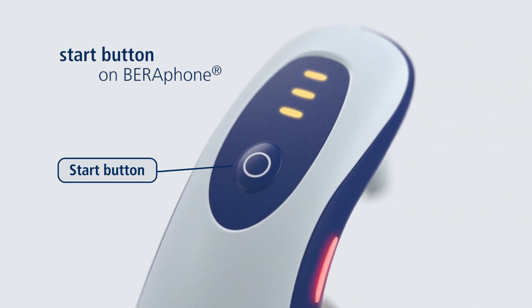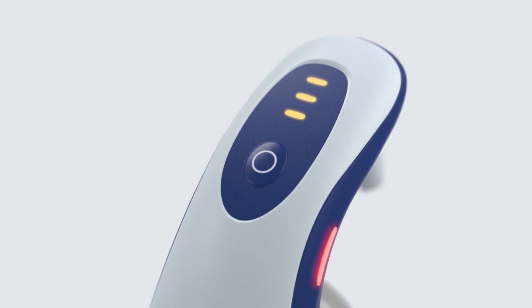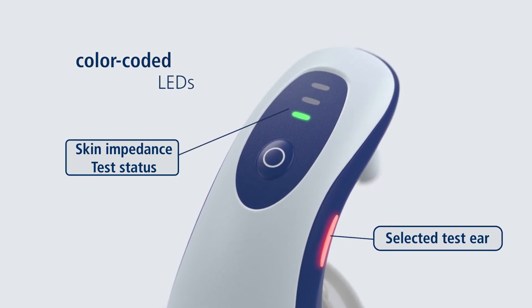Press the start button on the Barifone to begin testing, while focusing your attention on the baby. Color-coded LEDs show the selected test ear, as well as skin impedance and test status.